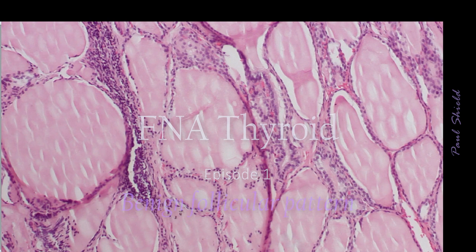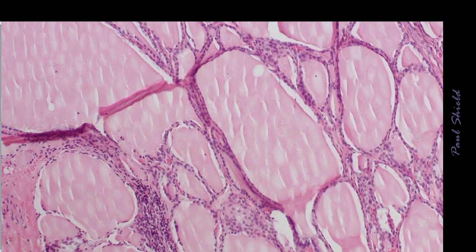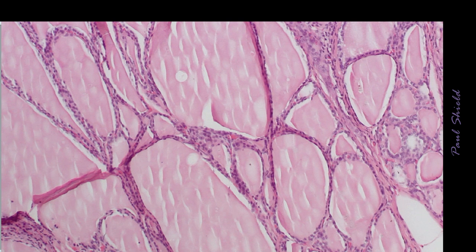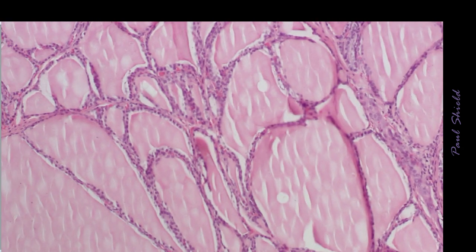Let's look at just a benign follicular pattern that's seen in thyroid. Just a reminder of what histology of benign thyroid looks like. So it's made up of all these different follicles of varying size, so some quite small ones to quite large ones, lined by follicular cells, and inside them is colloid.